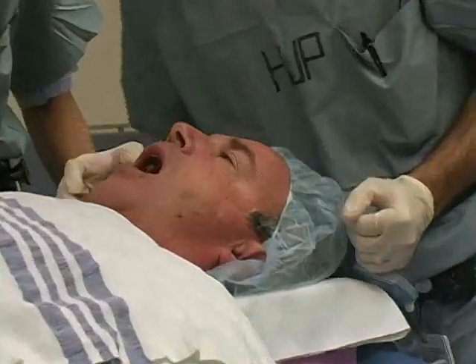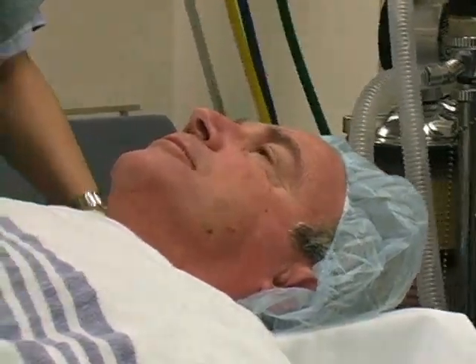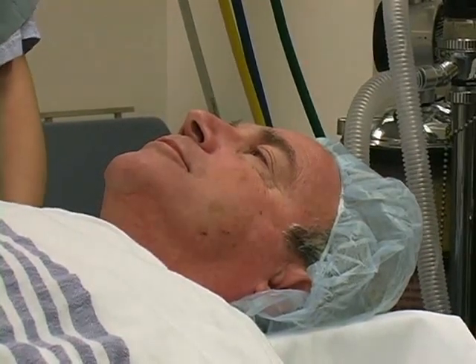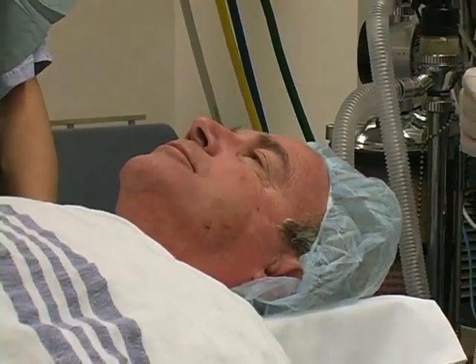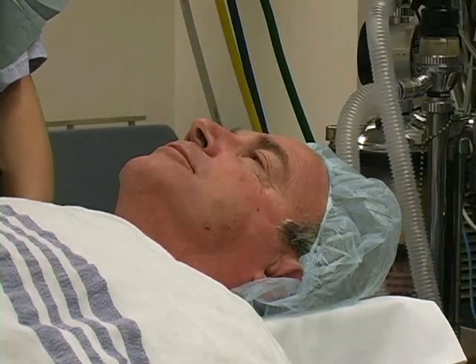Examine the patient's mouth prior to selecting a mask. Look for foreign objects, copious secretions, and loose or missing teeth. A mouth inspection, in addition to a full airway exam, is critical for non-emergent airway management.